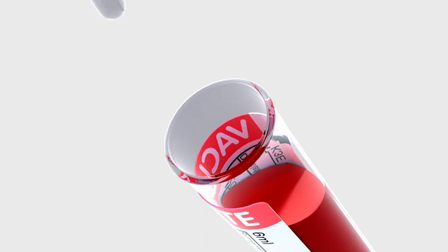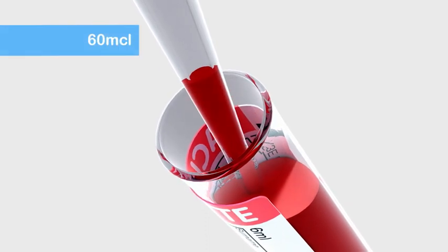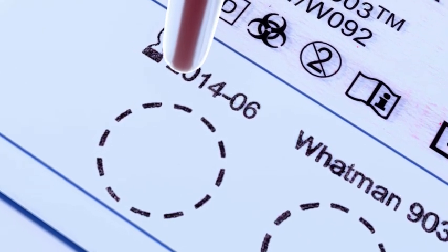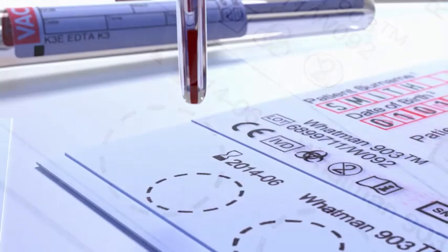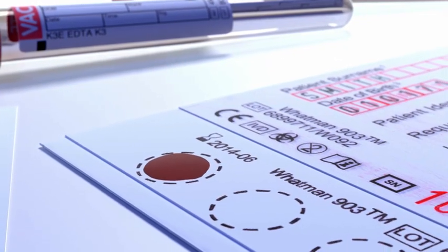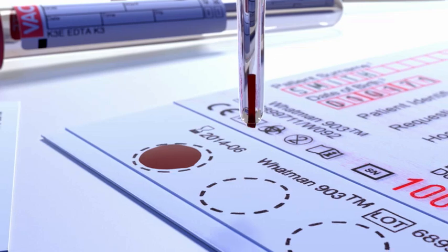Then set a handheld pipette to sixty microliters and fill the pipette tip with blood. Hold the pipette tip above the center of a circle, close to the surface, but without touching it. Gradually discharge the blood and let it soak into the paper, filling the circle completely with a single application.